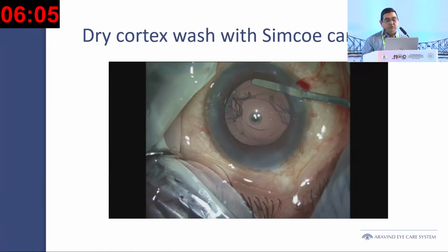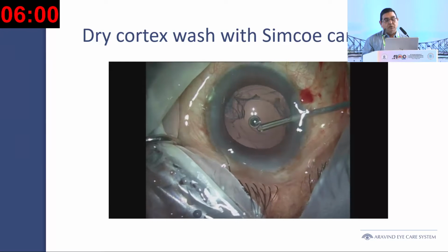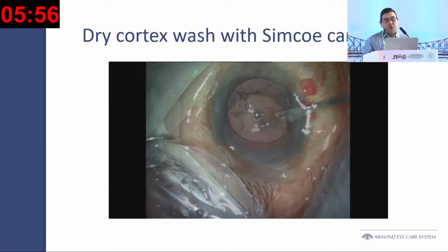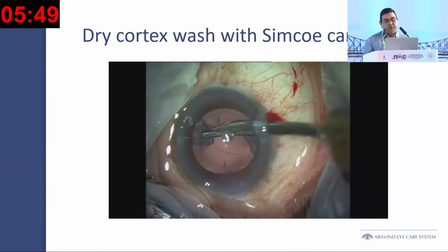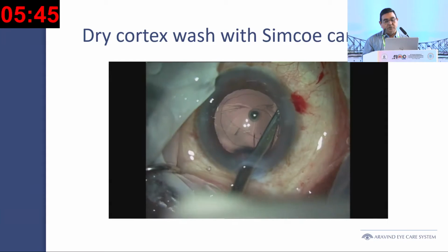So now it means that I need to do some vitrectomy. It isn't there, it is here. So I do a vitrectomy again and then proceed with removing the rest from the two corners of the PCR. After ensuring that there is no more vitreous, I go ahead and carefully peel it off, and you can see the other end of the PCR.